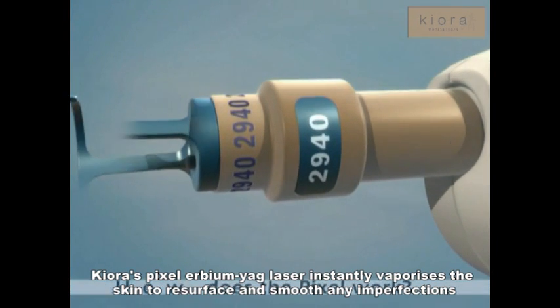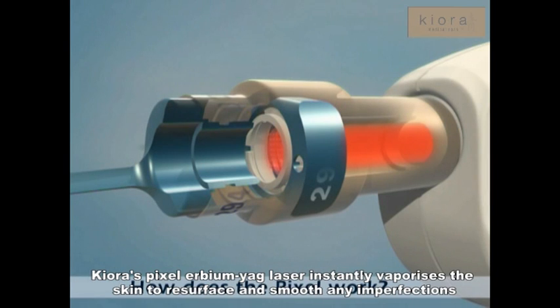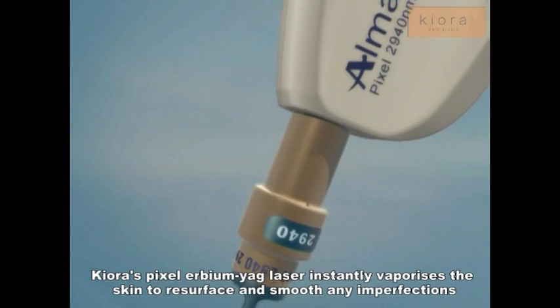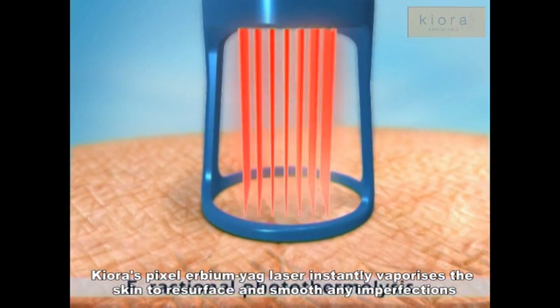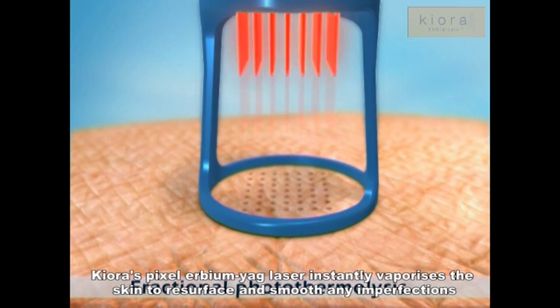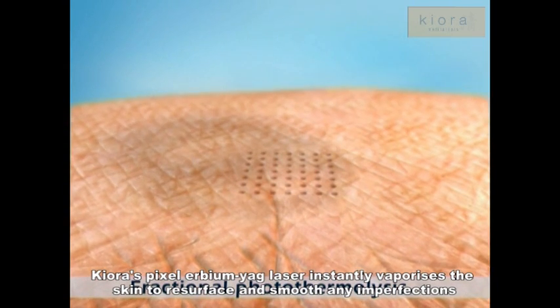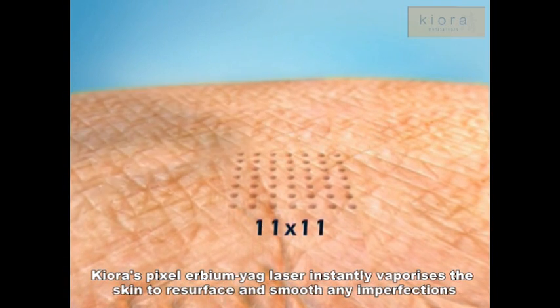Let's take a look at how the Pixel works. The Pixel laser beam passes through unique optics that divide it into multiple beams, arranged in either a 7x7 or 9x9 pattern. These multiple beams penetrate the epidermis and the upper dermis, creating a matrix of microscopic heat-injured zones called pixels, in an area of tissue 11 by 11 mm in size.